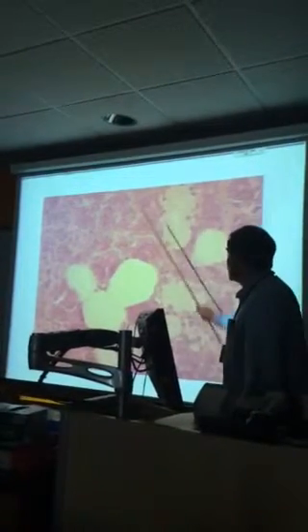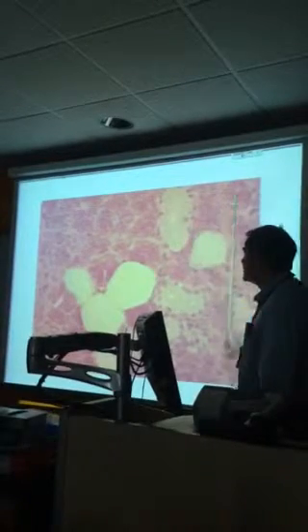And here again are your serous cells. Here again, the dark stained ones are serous cells. There's fat again, and there are mucus-like cells.